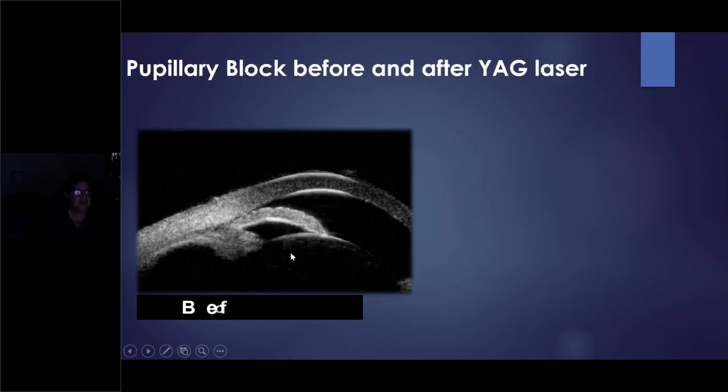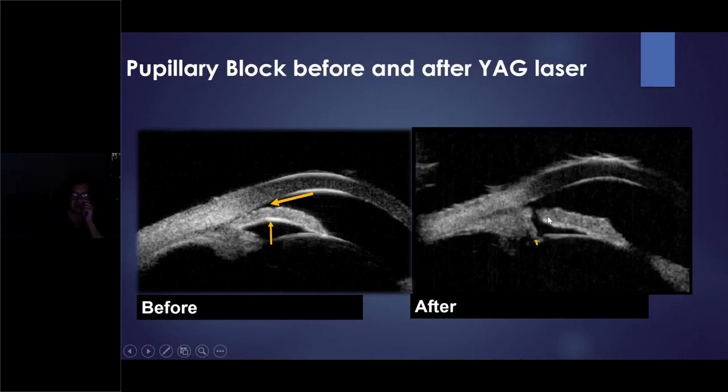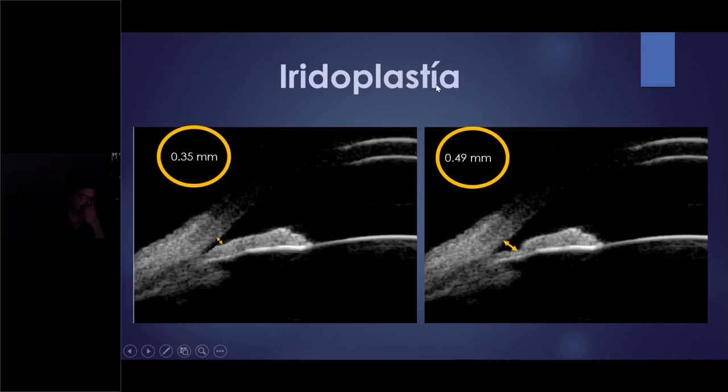Look what happened in the pupillary block before YAG laser and after, in the same eye. Then look at the opening of the angle, the communication, the stop of the bowing of the iris, because the pressure is here, the change of the contour of the iris and the position of the iris. Very interesting in glaucoma, the UBM. Also, if you perform iridoplasty, sorry for the Spanish, you can change this area in the same patient. These numbers sound like a small quantity, but hydrodynamically they are very important in the angle.